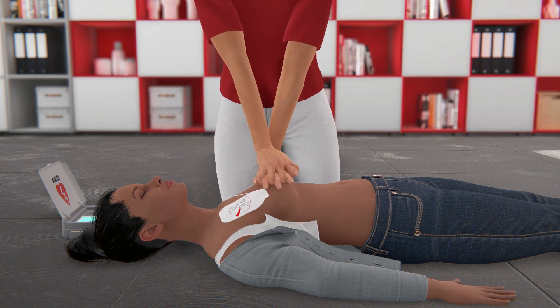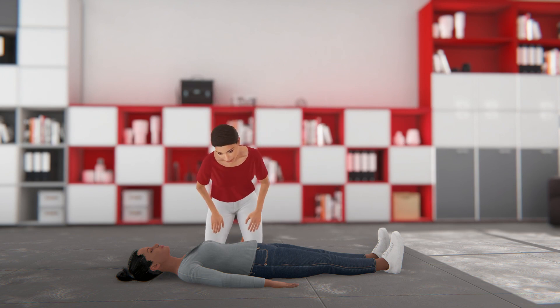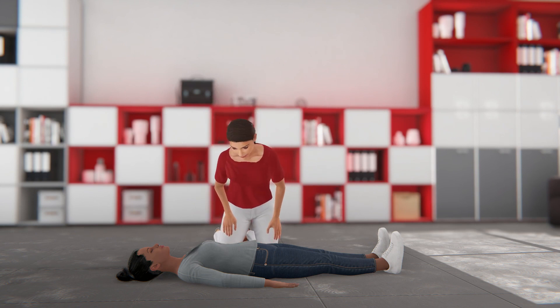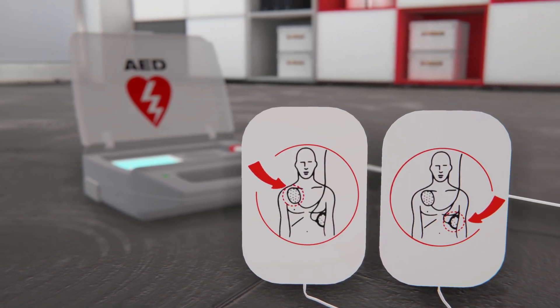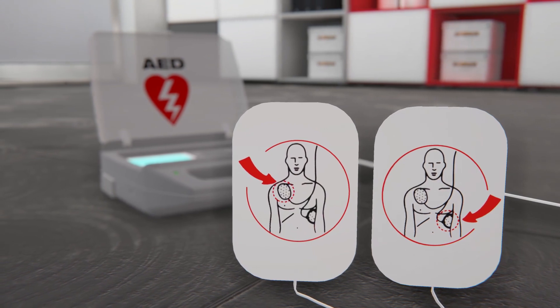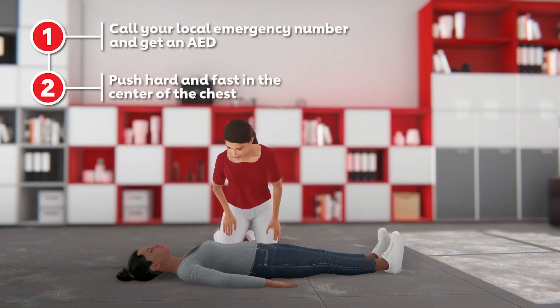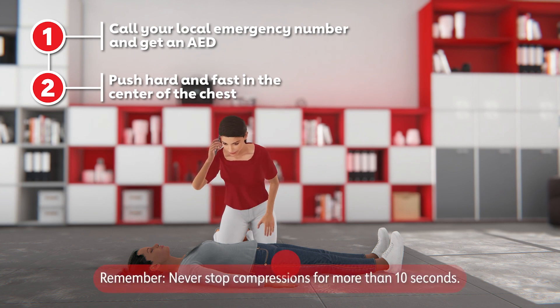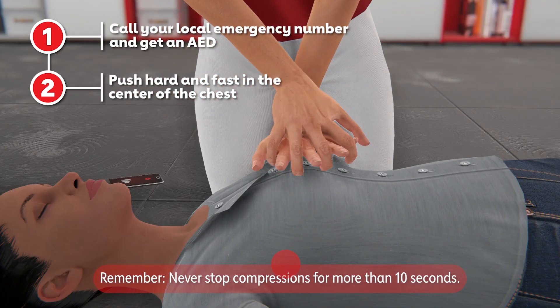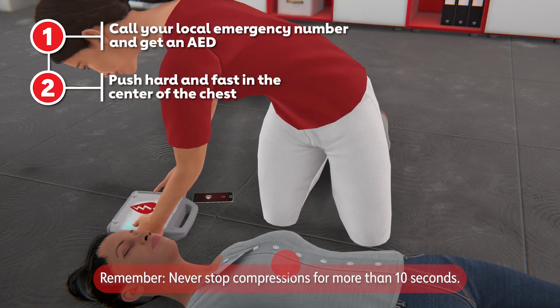Let's hope you never have to use hands-only CPR. But know that CPR combined with using an AED provides the best chance of saving a life. If possible, use an AED every time you provide CPR. If you see a teen or adult suddenly collapse, don't be afraid to start hands-only CPR. Remember, call your local emergency number and ask someone to get an AED. Then push hard and fast in the center of the chest until the AED and help arrives. Your actions can help save a life.